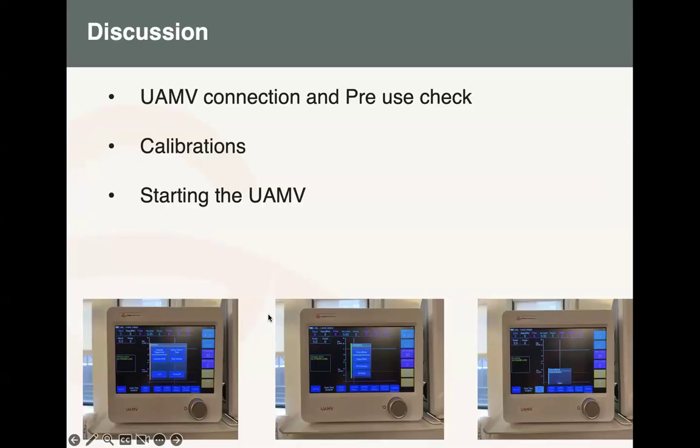This is what we are discussing. These are some of the challenges we have encountered. I don't know if any of you have encountered them, so that we can discuss how you managed. These are some of the areas we thought could be nice to share experience. Even the presentation insisted on making sure we are covering connection. As you have seen, we have received most of the calls. People say the machine has a problem, but when you talk to them, you realize it was a connection issue, a calibration.